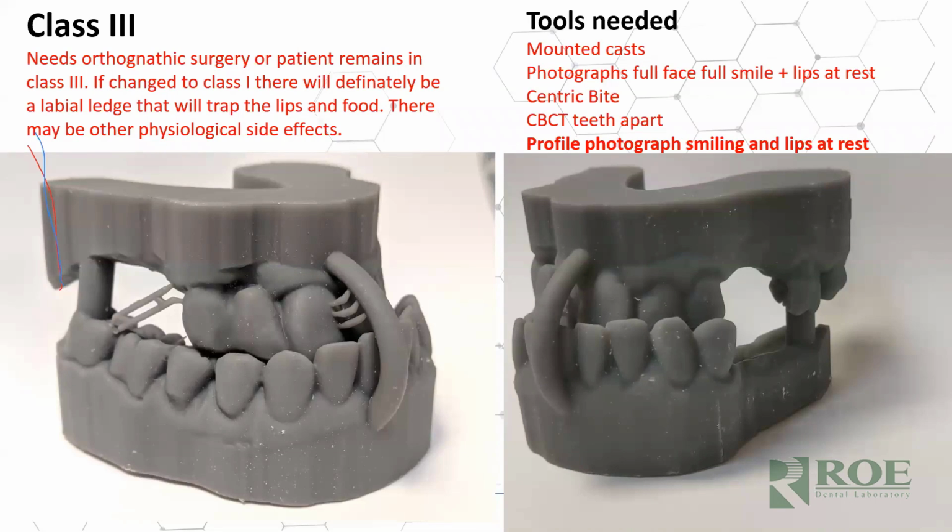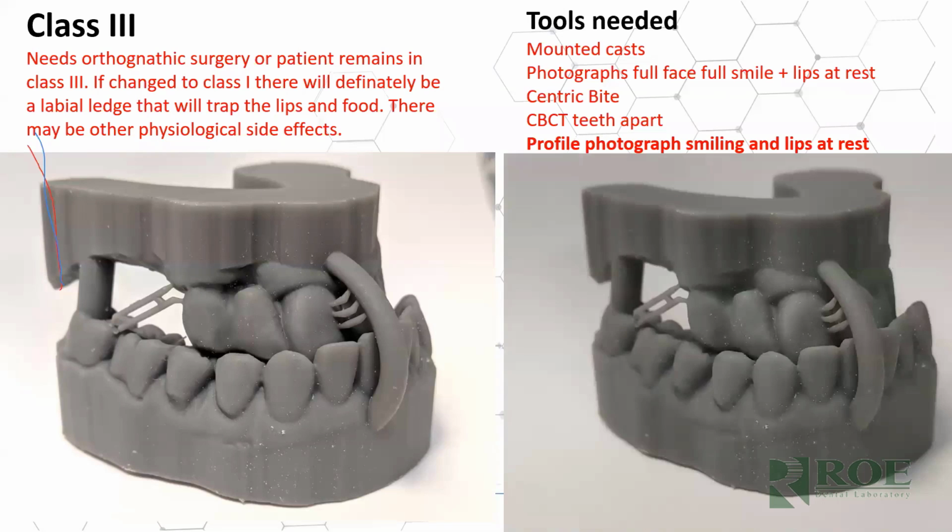You know, these are the normal records you'd send in. This patient probably has a repeatable bite, perhaps. Actually, the patient's missing an awful lot of teeth, maybe not. But anyway, often these patients should go a different route. This is probably a denture patient. This is probably an orthodontic patient, etc.